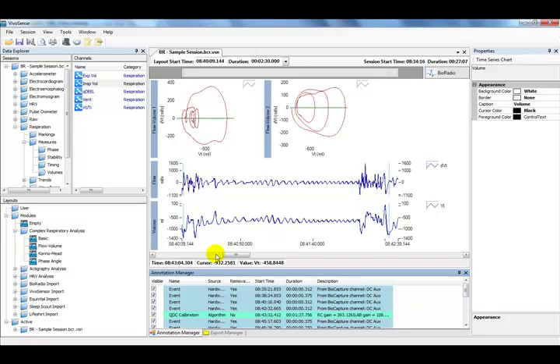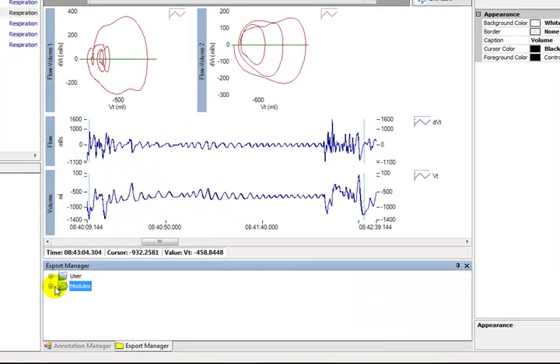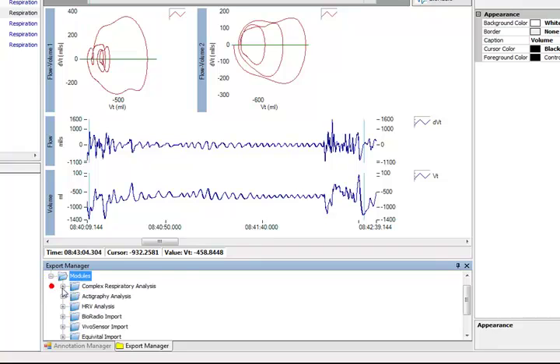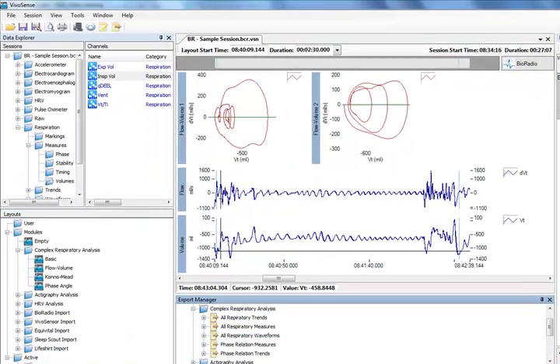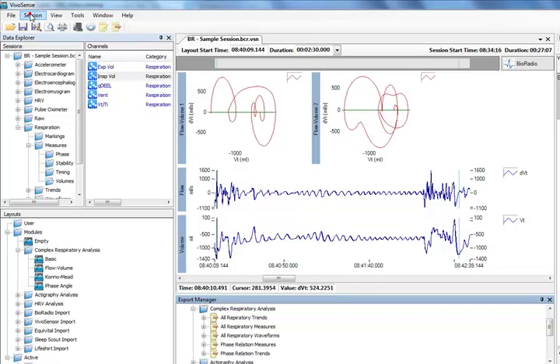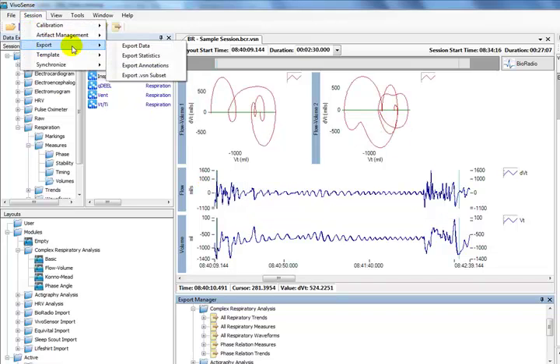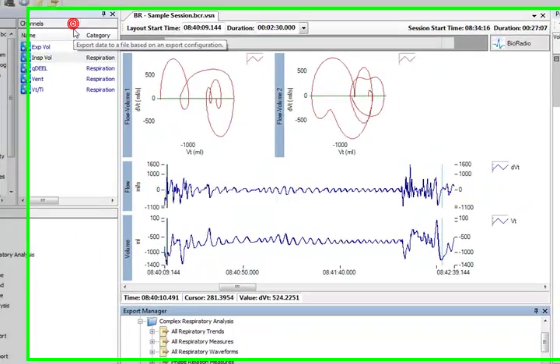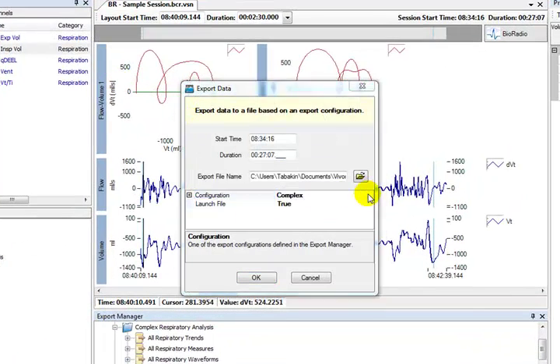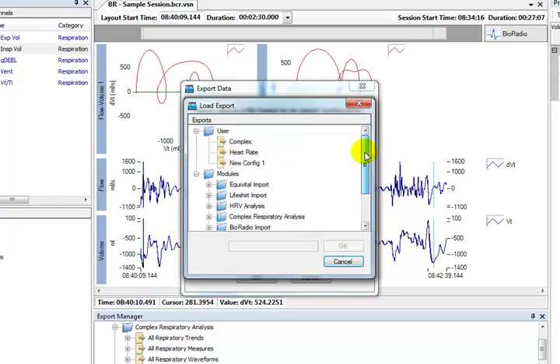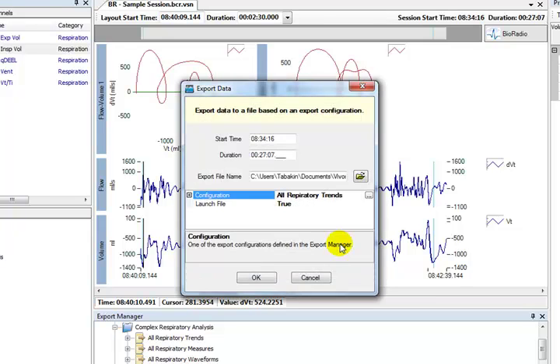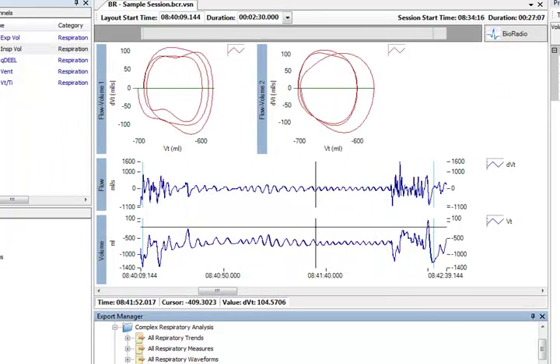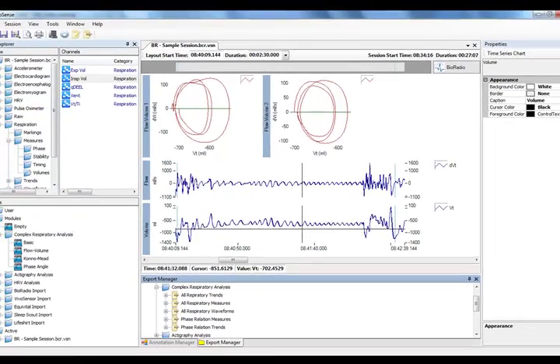Complex respiratory measures and basic statistics may also be exported using the Export Manager. You can create your own export configurations too using the Export Manager. To export complex respiratory data, we once again go to the Session menu, Export, Export Data. We select the appropriate Complex Respiratory Analysis Export Configuration that we would like to export. Watch the Getting Started with VivoSense video for more details on the Export Manager and Exports.